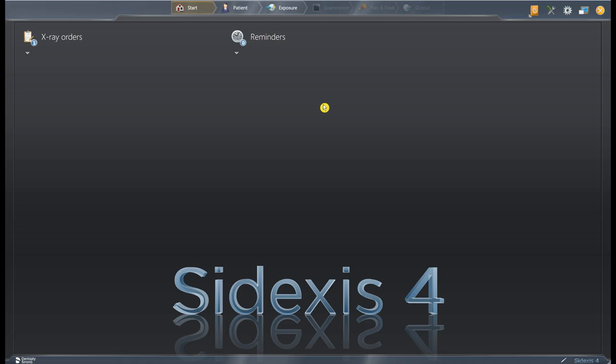Hi, this is Quentin Flores with CBCTmadeeasy.com and in this video we're going to focus on the ins and outs of using Sidexis 4 for your Schick 33 intraoral sensors. We're going to go through a brief process of how to capture and also just some basic navigation of the timeline, the light box, using the compare feature — just a few things that you'll probably use on a daily basis to make you a little bit more comfortable with the software.